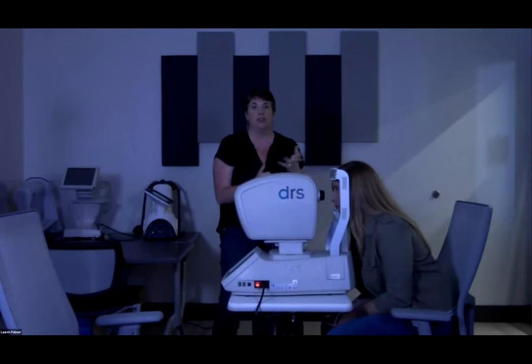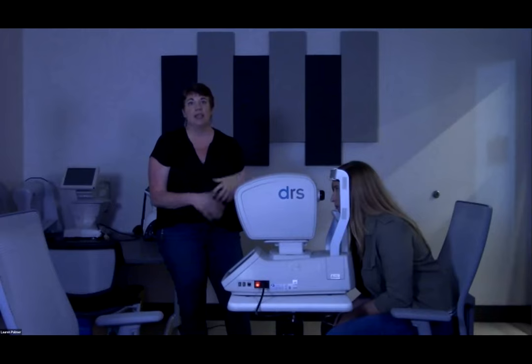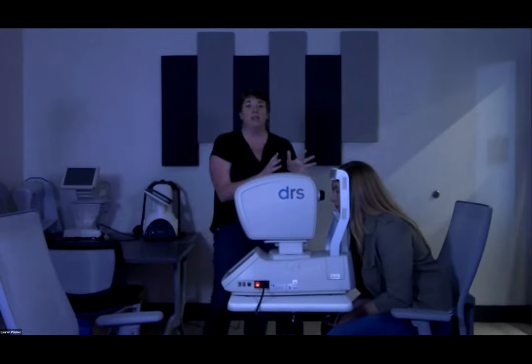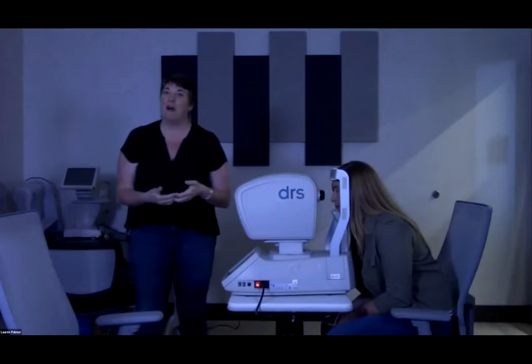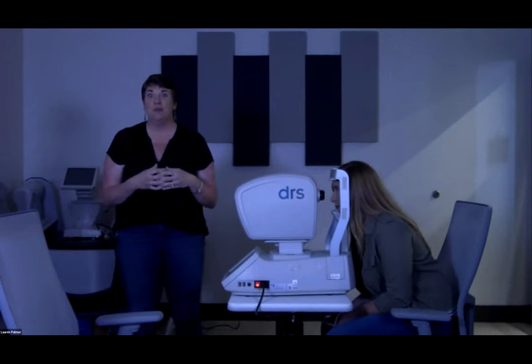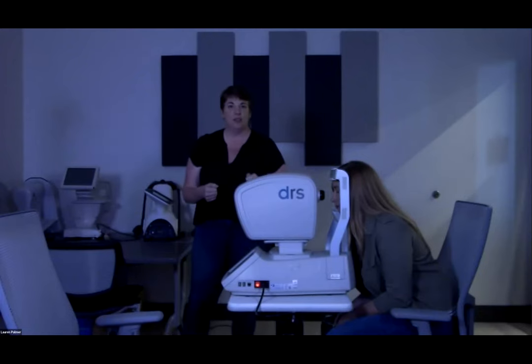As Rebecca mentioned earlier, when you're explaining the exam and getting things adjusted, having the lights off but the door cracked lets you come and visualize how the patient is looking. Are they correctly positioned? It's also very important to ask your patient, are you comfortable? If your patient is uncomfortable, they are likely to move during the exam and that can impact your image quality. So again, forehead against the bar, chin centered in the chin rest, and then you'll be able to go ahead and perform the exam.